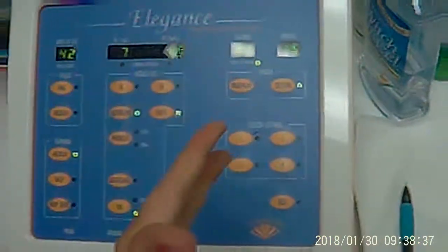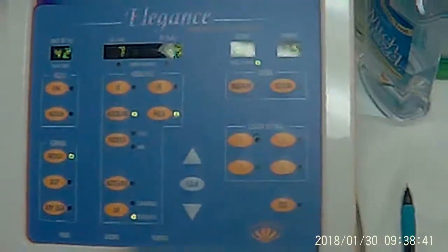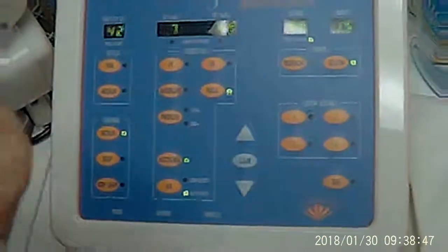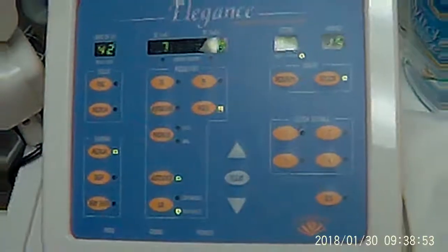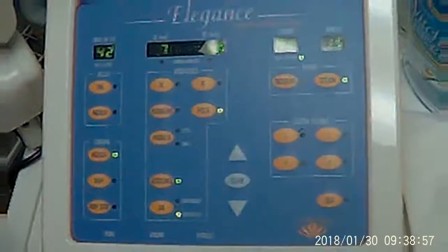Now, if you want to do auto sense, I don't recommend that unless you're really experienced. It will automatically start when you insert the probe, and then you've got to wait until it kicks off — you hear the beep. Because if you pull it out before it does, you're going to harm the epidermis and potentially damage the skin.